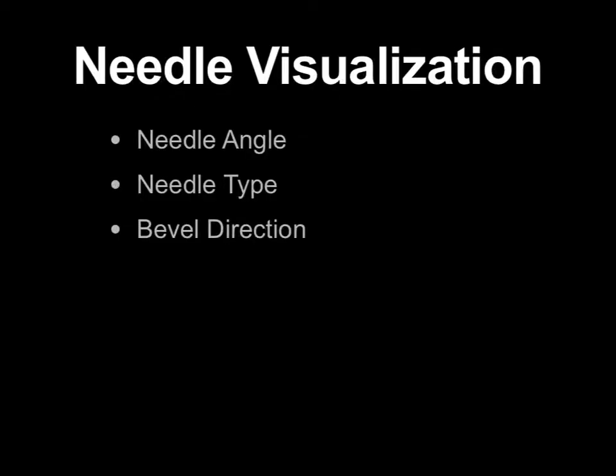Needle visualization is going to be key because anytime you're doing an ultrasound-guided procedure, it's all going to be based on visualizing the needle.